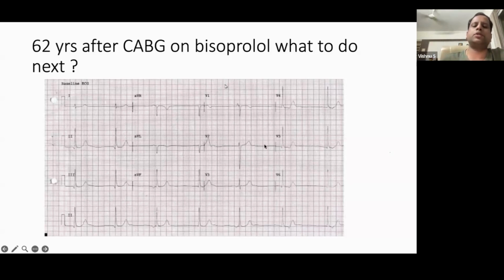This patient doesn't have any syncope or giddiness, so just make him walk and take an ECG. His sinus rhythm will take over, and usually if the heart rate increases, then only you take the next ECG. Then we will know whether it is significant SA nodal disease or conduction disease, or just vagotonia causing these things.